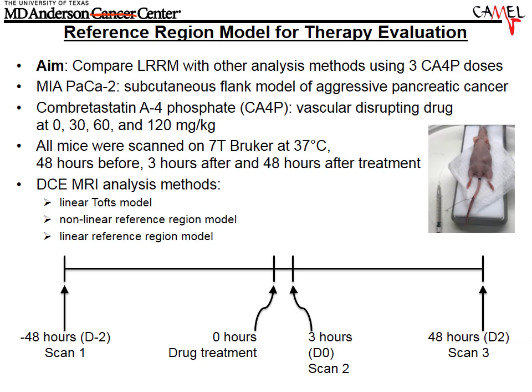We also recently performed a preclinical study. This happens to be a pancreatic tumor model, but we've tested many breast cancer models in the past. In this case, we scanned 2 days before administering a vascular disrupting agent. Then we applied the agent. We imaged exactly 3 hours later because this vascular disrupting agent has very well-known effects on the tumor biology. And then 2 days later, we did another scan as well.